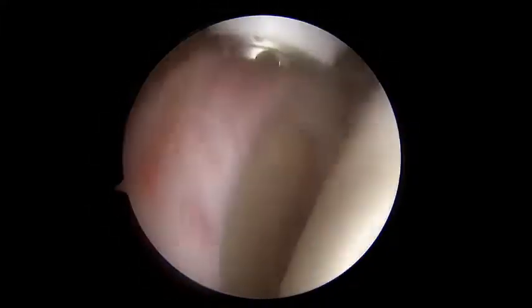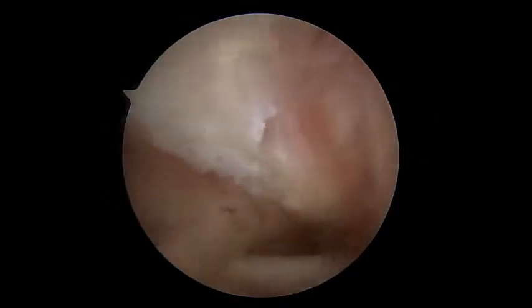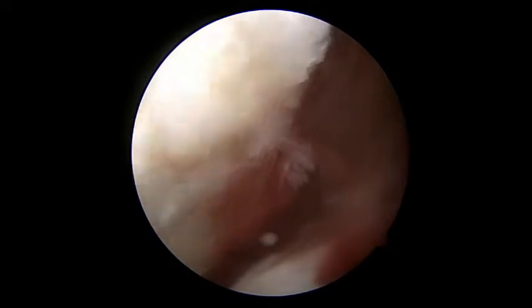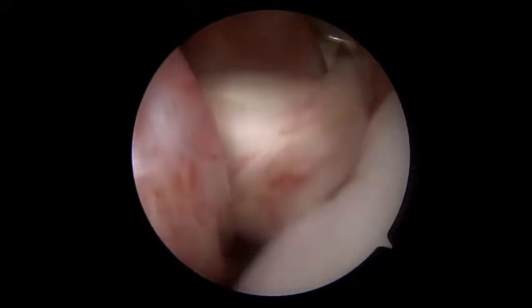An arthroscopic shaver is utilized to the anterior portal to debride synovialized tissue. The rotator interval is released to facilitate subscapularis tendon mobilization. An arthroscopic grabber is used to confirm adequate mobilization of the subscapularis tendon.